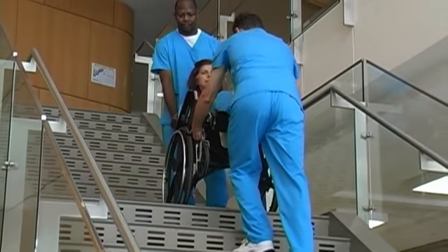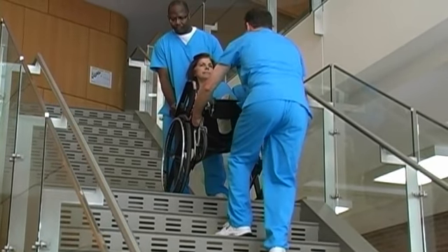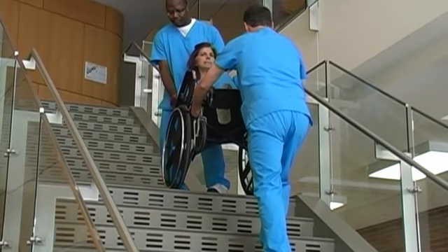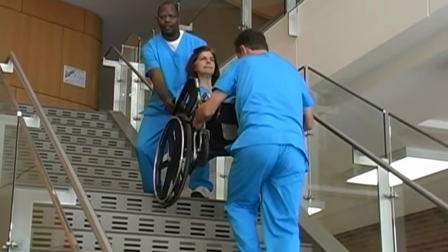Working together and bending at the knees, they slowly lower the wheelchair. One person holds the wheelchair while the other person moves to the next step.